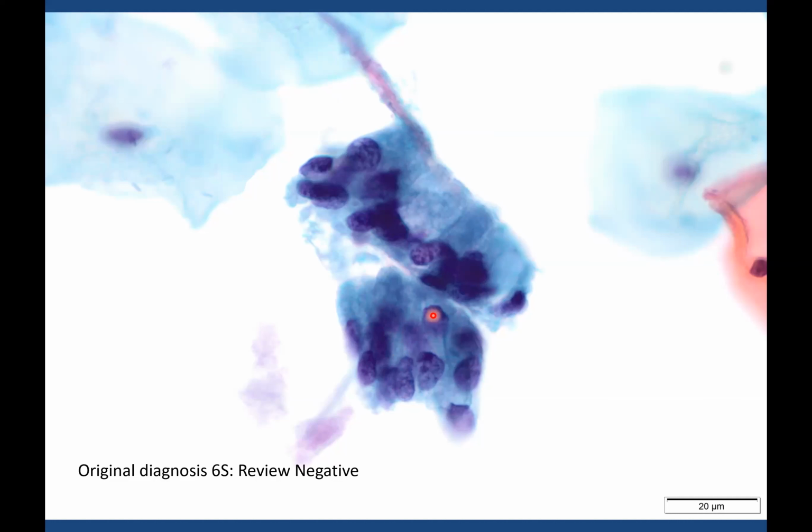And in this instance up here, it's slightly higher, but I would say that probably these may not be so well orientated and slightly twisted. And then when we look at the nuclei, actually the chromatin is the same across all of them. The nuclear contours are smooth, and I look at this and I still see that within the realms of being normal endocervical cells.